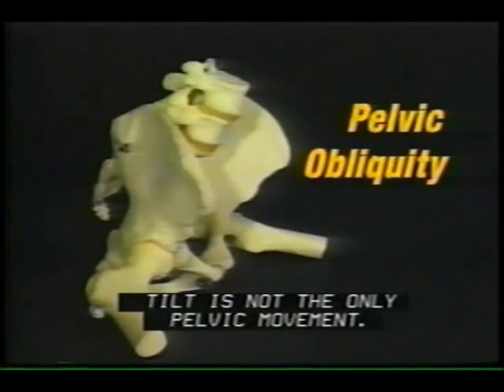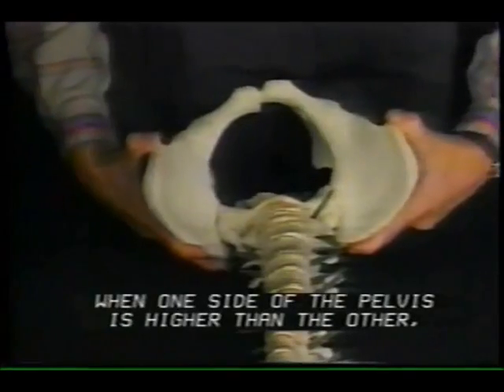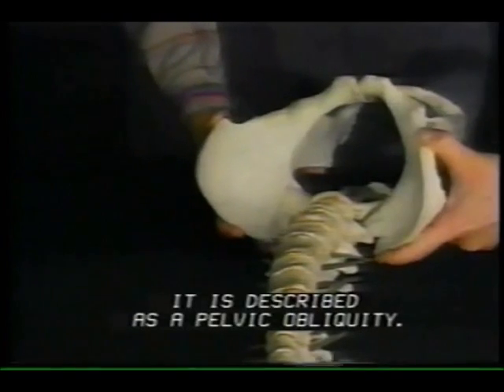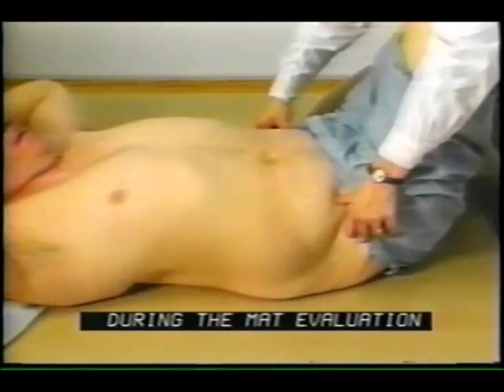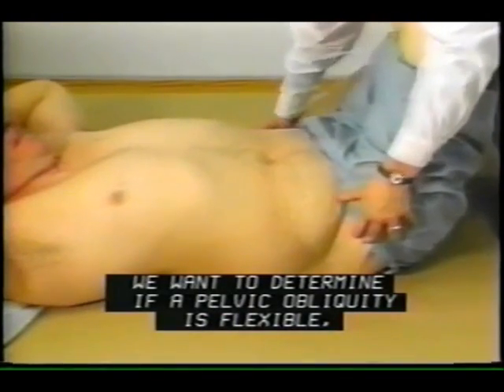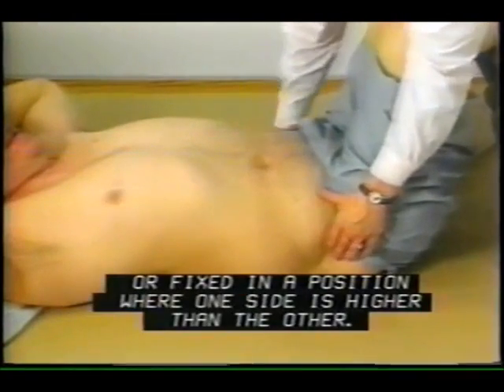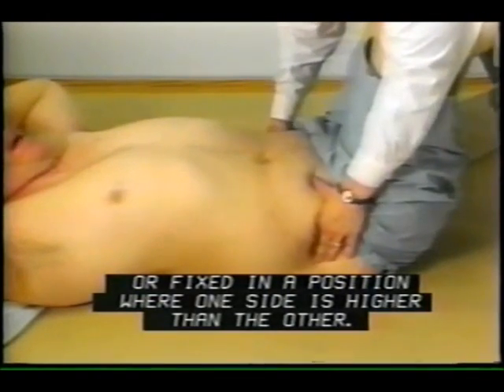Tilt is not the only pelvic movement. We also want to feel if the pelvis can move side to side. When one side of the pelvis is higher than the other, it is described as a pelvic obliquity. During the mat evaluation, we want to determine if a pelvic obliquity is flexible, free to move from one side to the other, or fixed in a position where one side is higher than the other.